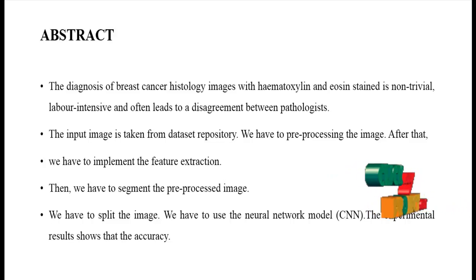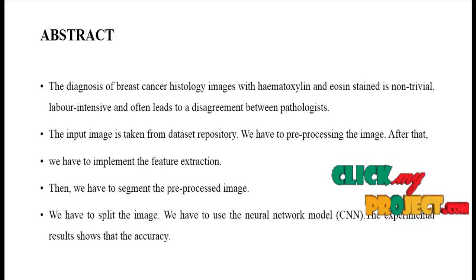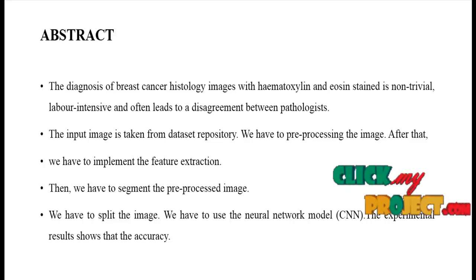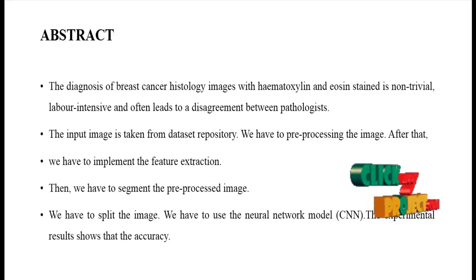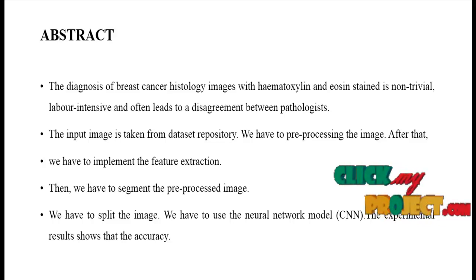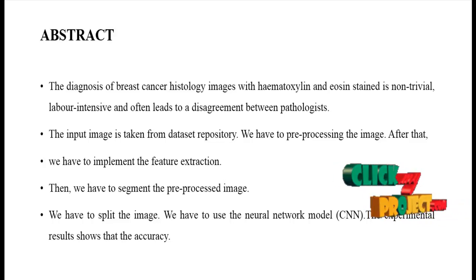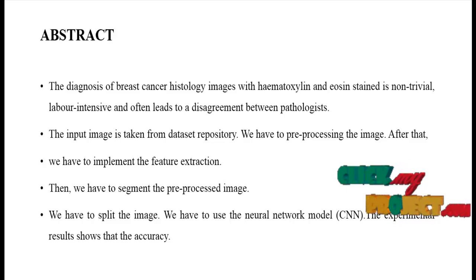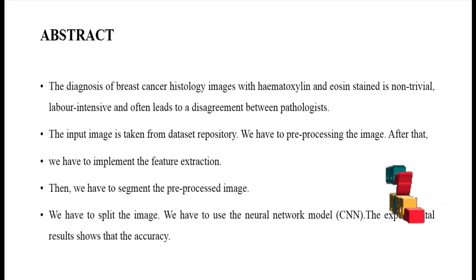Here we apply the CNN, that is, the convolutional neural network model. The convolutional neural network is used for recognition and classification because of its high accuracy. The experimental results show the accuracy, and it also displays the affected region from our input image.